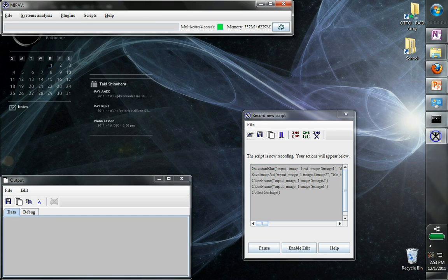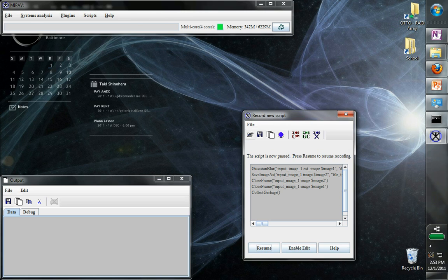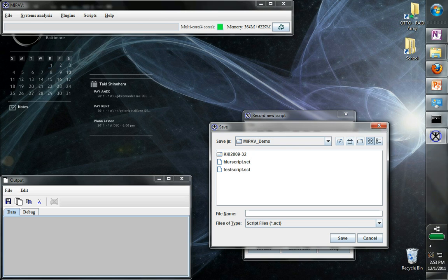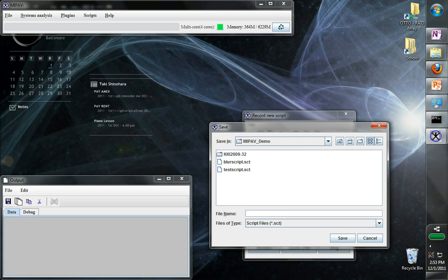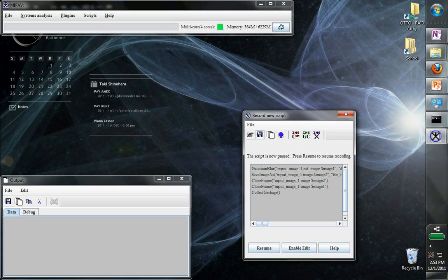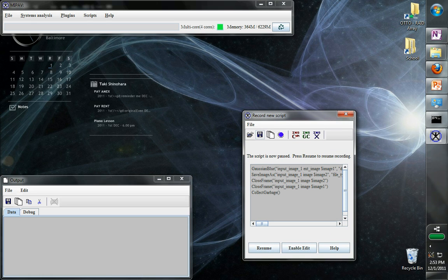So now that we have the whole script written, we can pause it and save it. We can save it, for example, as this. And now we can close this.